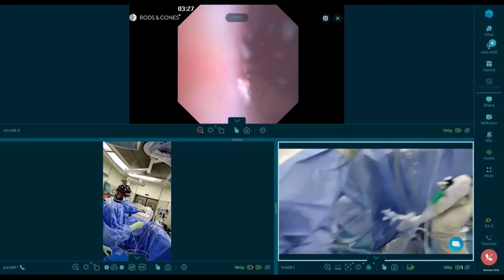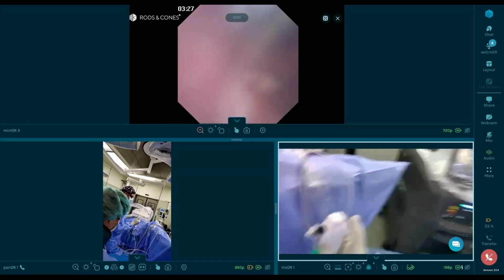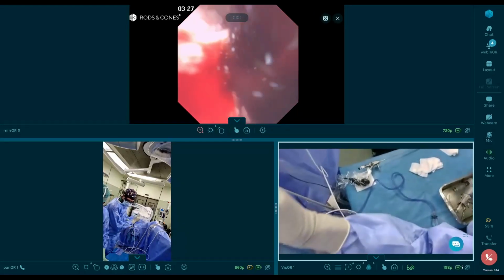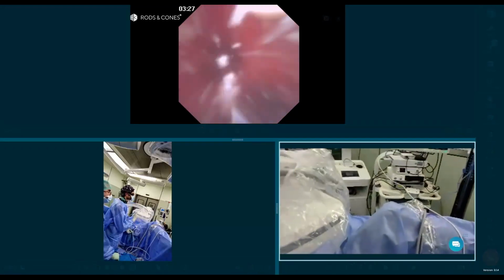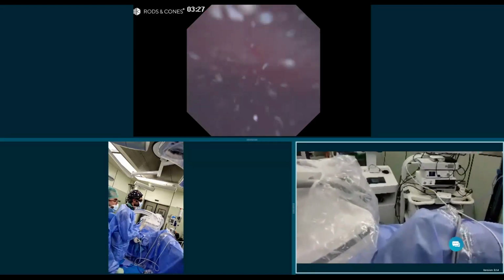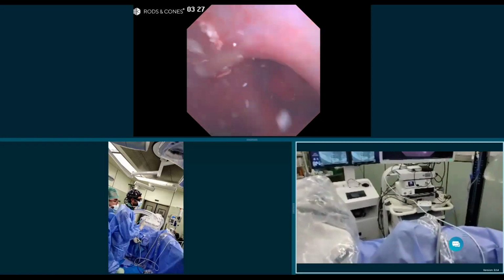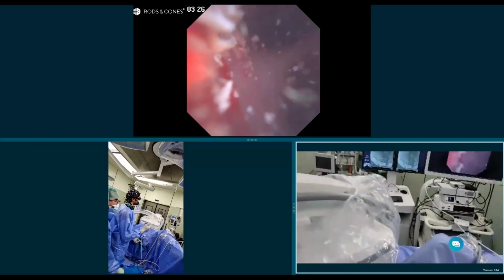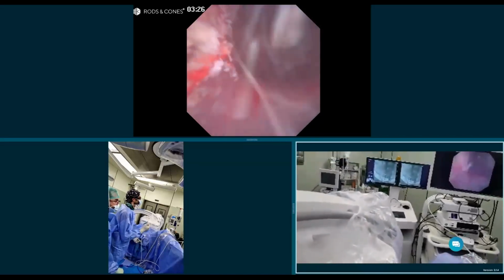I want to have a last look up. And I'm going to tell Pedro to just pump a little bit at the end. I really like what I see. This is the lower calyx, mid calyx here. Pum, pum, pum, pum. So everything clears.